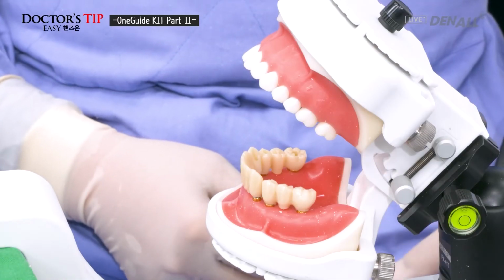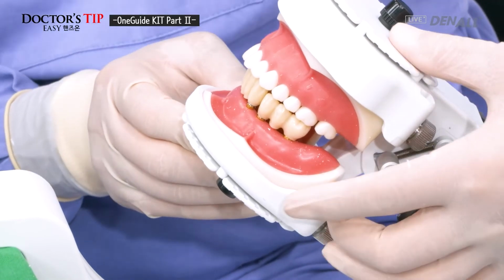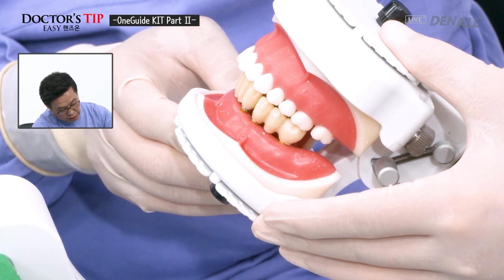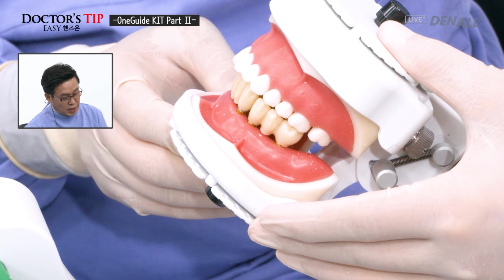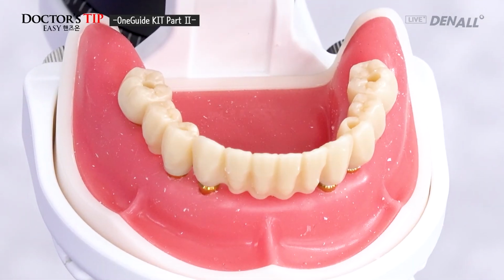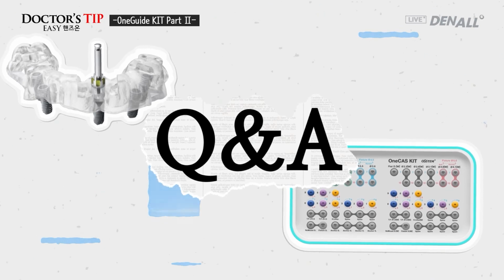Provisional has been done well, and let's check at the occlusion and relations with the opposing teeth. As you can see, on computer, we planned the final prosthesis, and it has come out into reality. Now, provisional restorations have been delivered. Finally, abutment, we're going to tighten the torque, and cementation is going to be done, and they deliver temporary prosthesis, and everything is done. This has been today's hands-on. The hands-on practice is complete.